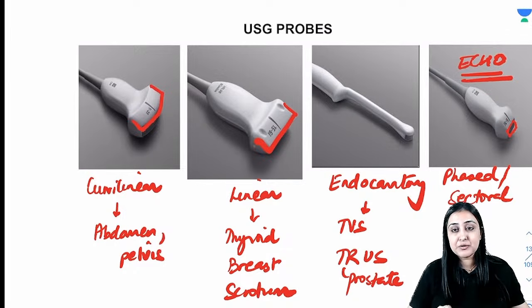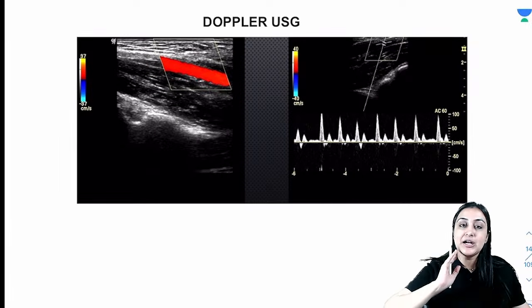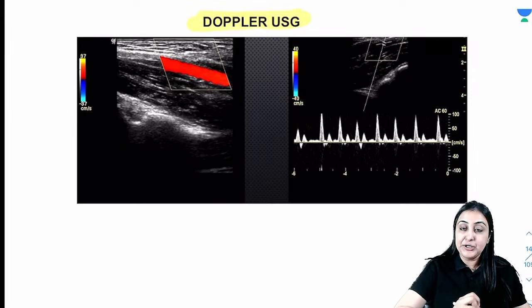I'm expecting one question from this. All right, very, very important. Going on to Doppler. So whenever I want to study blood vessels, I am going to be using Doppler effect.